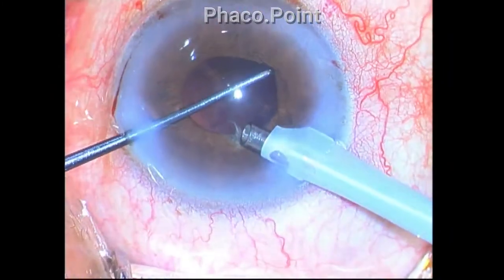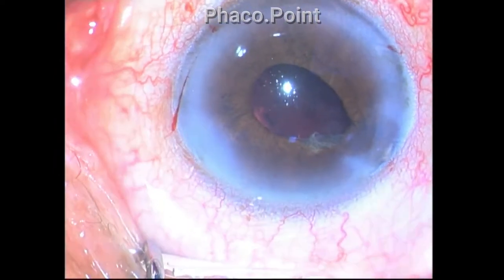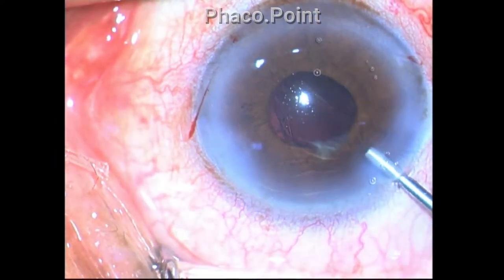Nucleus disassembly has now been successfully completed. While pulling out the phaco probe, the iris has a tendency to prolapse and is reposited with viscoelastic.